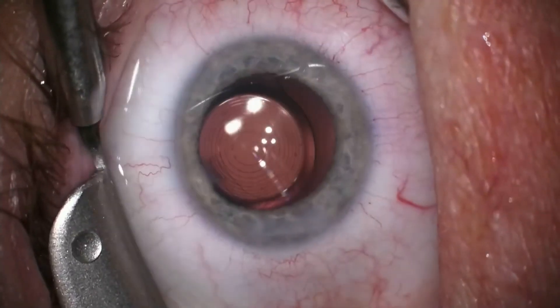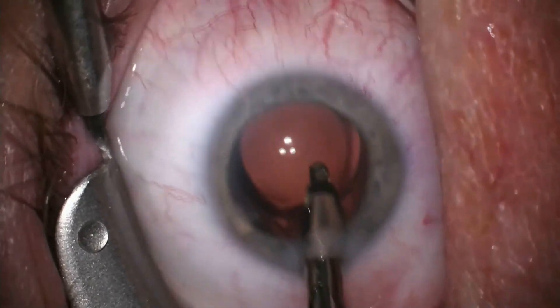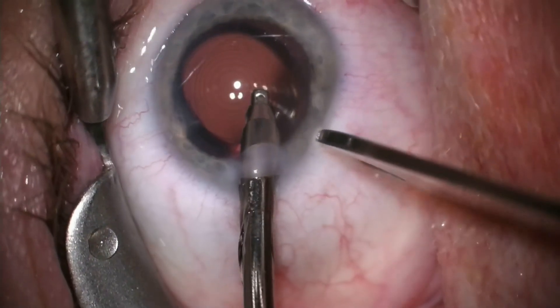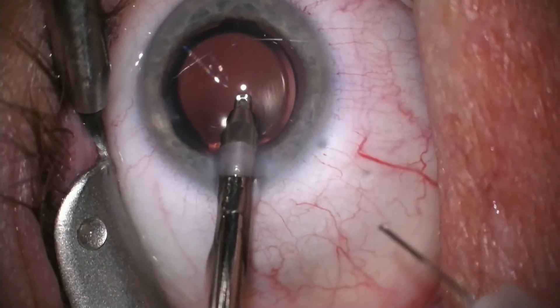In a moment I will be inserting an antibiotic anti-inflammatory medicine into the back of the eye. This will aid in the healing and allow the patient to recover with only a minimal number of eye drops after the procedure.